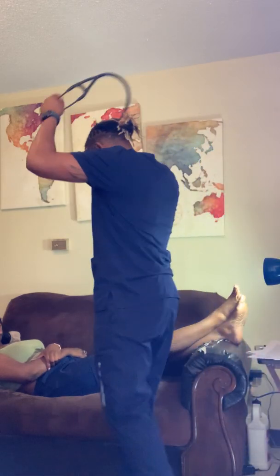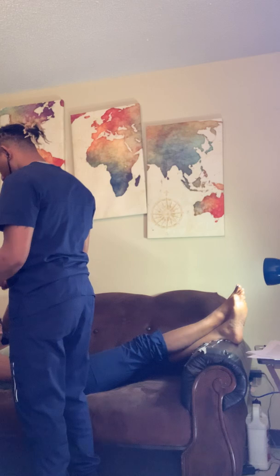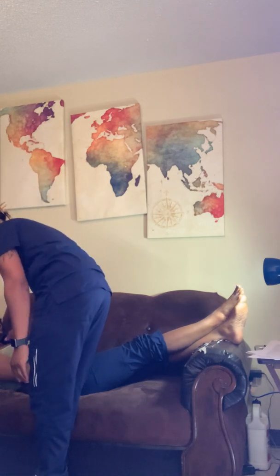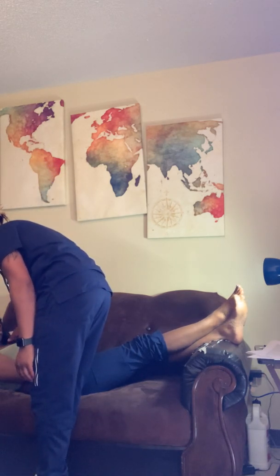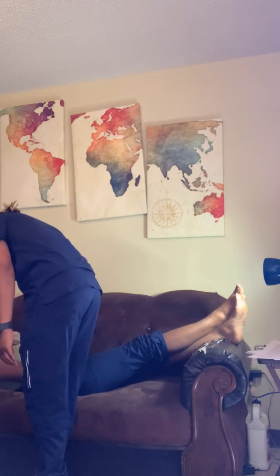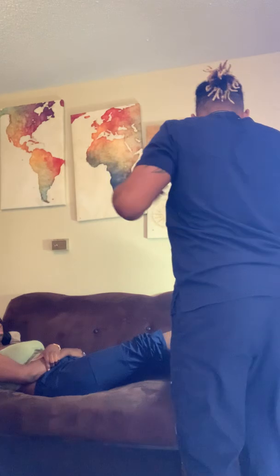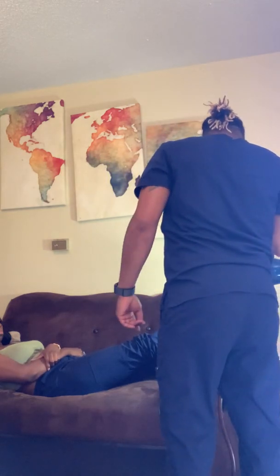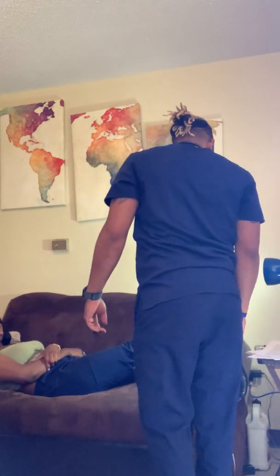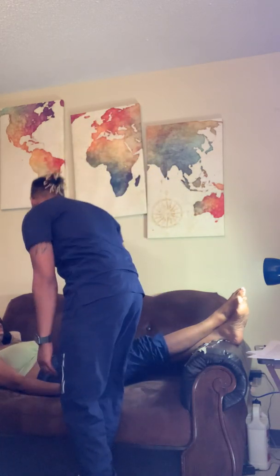Now we'll auscultate with the diaphragm. Aortic, pulmonic, tricuspid, mitral. Now we'll move down to the abdomen. So place your arms to the side.